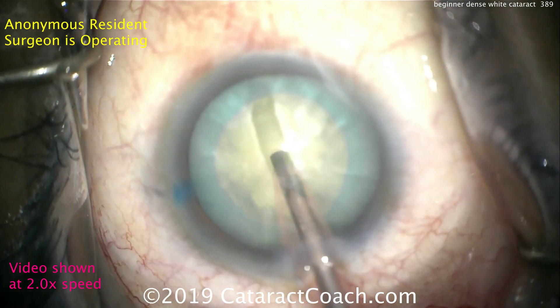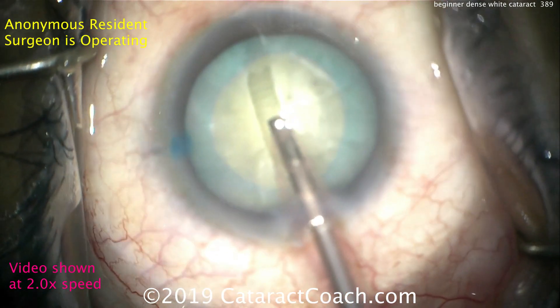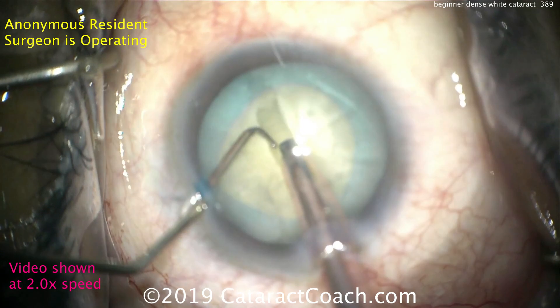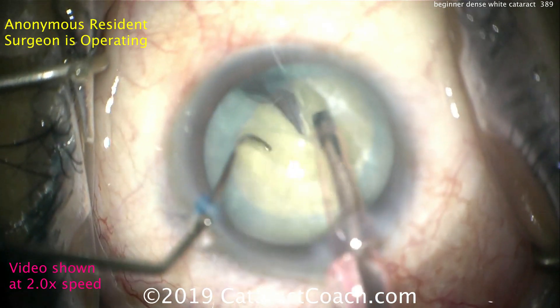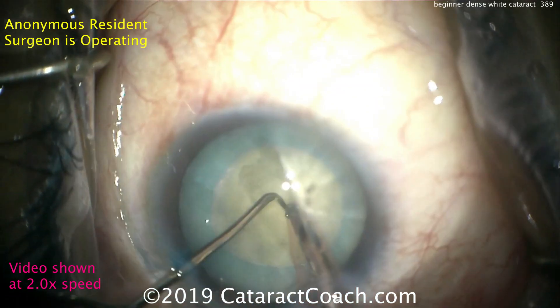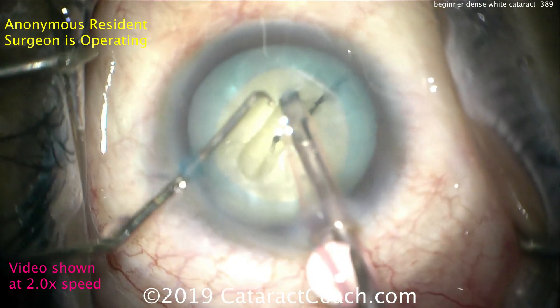Here you can either widen the groove or continue to go deeper, but you can see the sleeve starting to hit the groove, so maybe you want to try widening it a little. Chopper going in the eye — are we going to crack it in half? It looks like it. There's a crack going, just propagating it all the way through. It may be a little tough to propagate through the sub-incisional area because there's not much of a groove there. Rotate the nucleus around now.